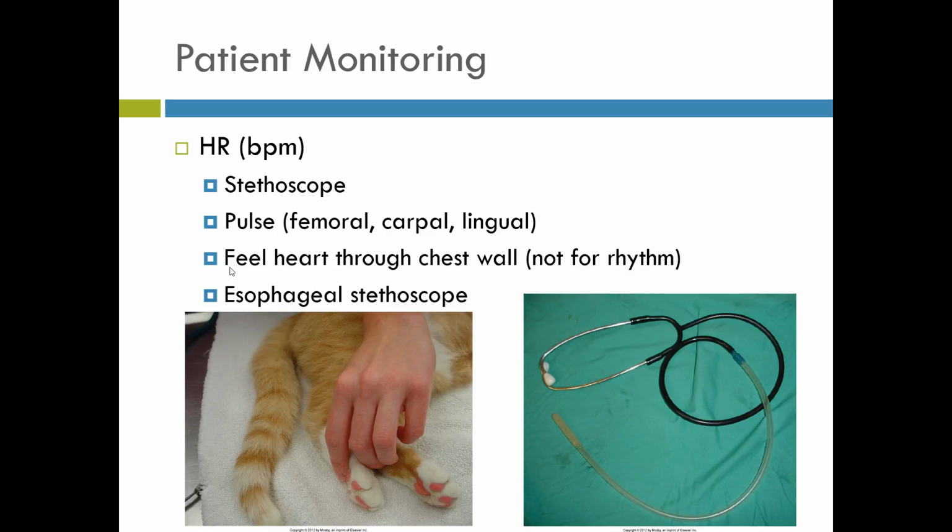We can also use an esophageal stethoscope. This is a really cool stethoscope that's over here. This goes down the esophagus, and it sits right next to the heart, and so you can hear their heartbeat very, very strongly, which is really cool.